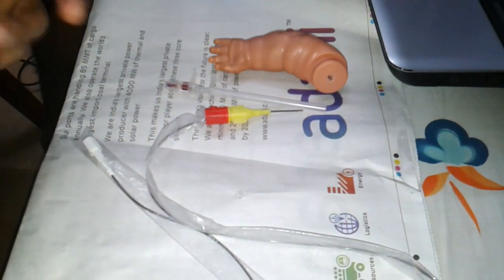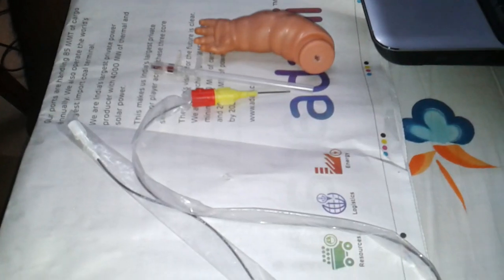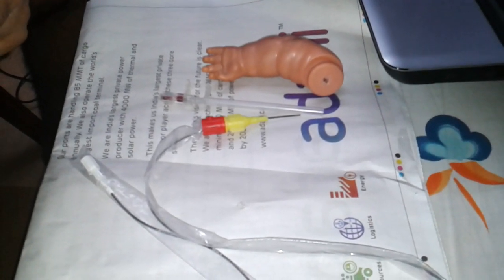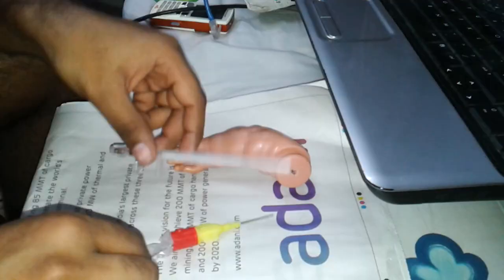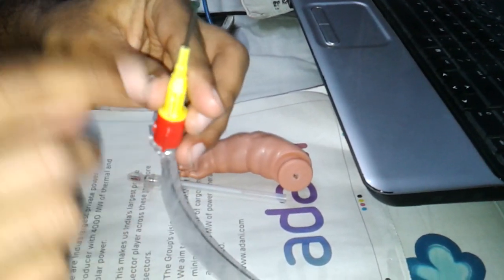Good evening everyone. Under Dr. PK Girpade's part 3 series, we present the procedure to put a keva fix. This is the arm of a baby, Chinku. This is a stilette, and this is the hollow tube containing the guide wire.